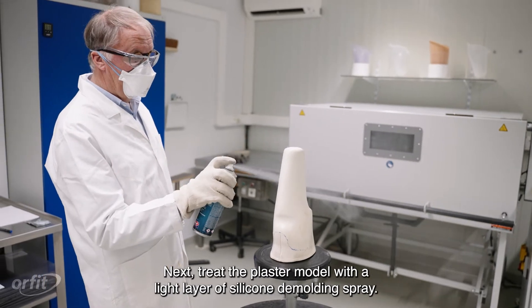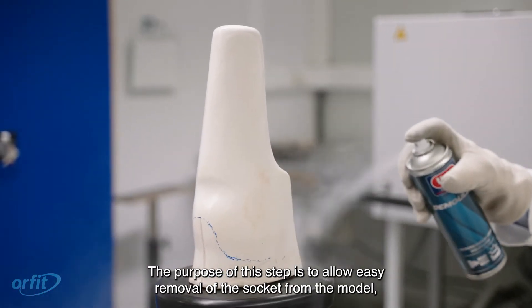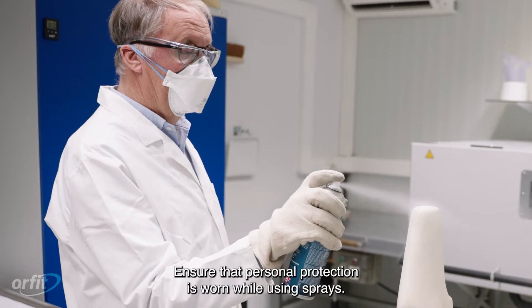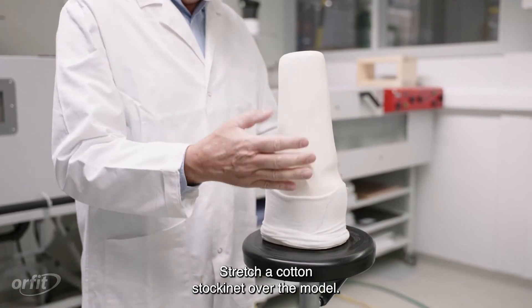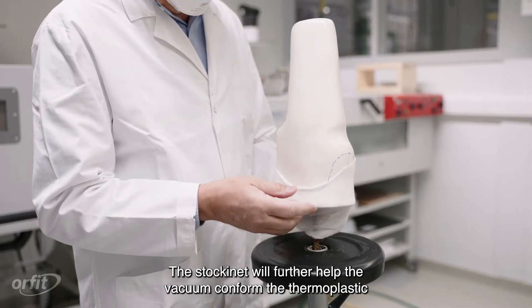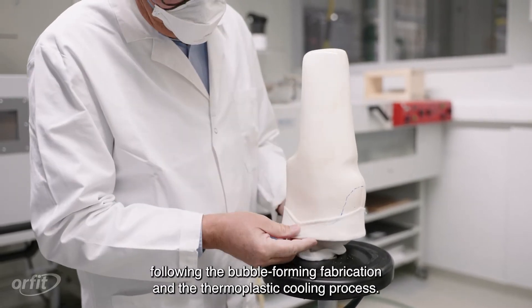Next, treat the plaster model with a light layer of silicone demolding spray. The purpose of this step is to allow easy removal of the socket from the model following socket fabrication and the thermoplastic cooling process. Ensure that personal protection is worn while using sprays. Stretch a cotton stockinette over the model. The stockinette will further help the vacuum conform the thermoplastic and will also help with removal of the socket following the bubble-forming fabrication and thermoplastic cooling process.